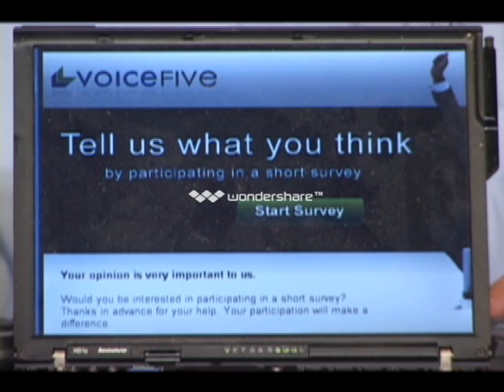And so this little highlighter is there, and so the sighted person can say, "Oh, it's over there on the top left of the screen," and you don't know where the heck you are on the screen. It doesn't matter to me if it's at the top left or not.